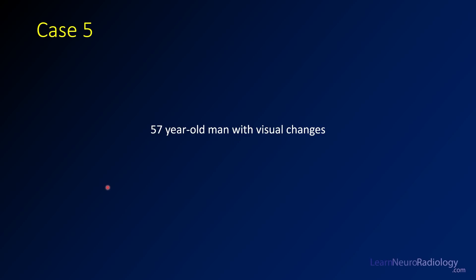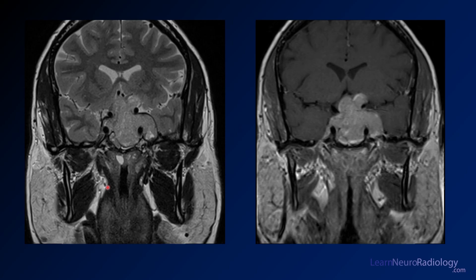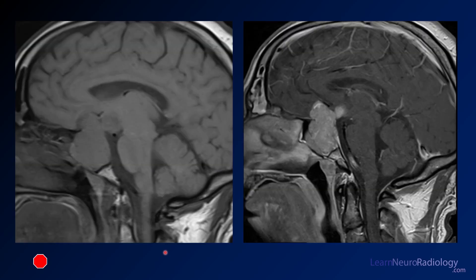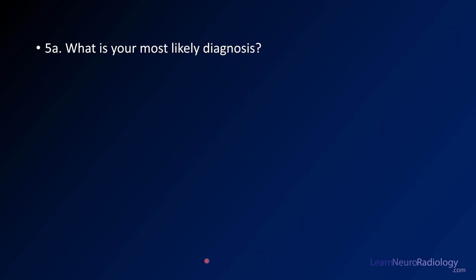Welcome back everyone as we cruise through these brain tumor board review cases for the spring of 2022. Case number five: a 57-year-old man with visual changes. On his imaging here you can take a look at why he might be having visual changes — a coronal T2 and a coronal post-contrast. Take a look at what you might think the abnormality is. Your first question is: what's your most likely diagnosis?